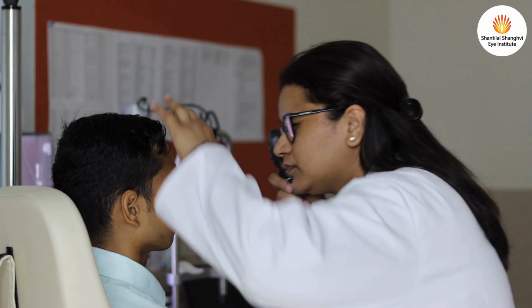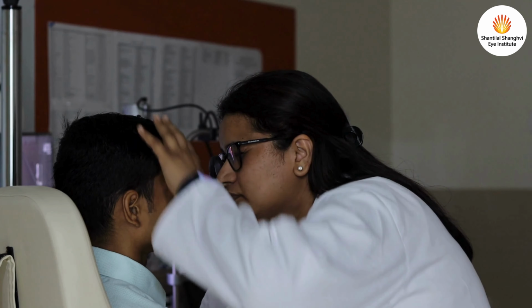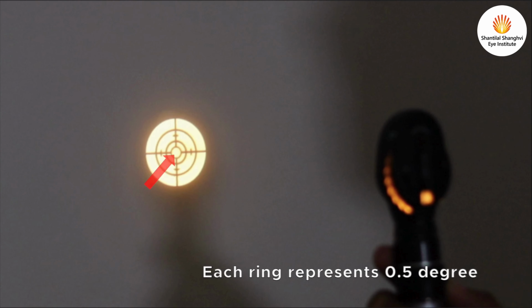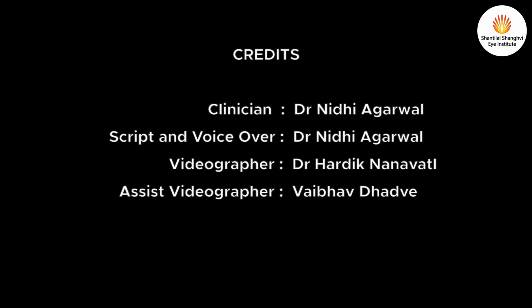Lastly, for assessing eccentric fixation, the graticule present in a direct ophthalmoscope is projected onto the macula of each eye separately while asking the patient to look into the central small circle. This point is normally the fovea in a patient with BSV. However, in microtropia, the macular point that takes up this fixation can be parafoveolar. This is how a complete clinical evaluation of microtropia is done.